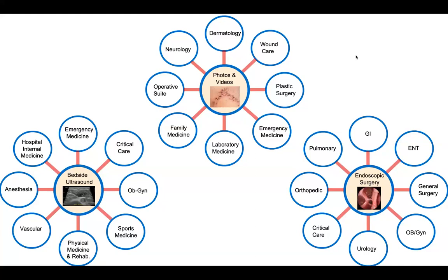So encounter-based workflow has been successfully employed in a lot of different settings to capture and assign metadata to these basic areas, like point of care ultrasound at the bedside with various specialties that do it, and photos and videos that can be of any number of different things, normal body parts, abnormal body parts. When you really zoom in on some small clinical area, a lot of times you don't know what body part it is or what pathology it is, because in many cases people are taking pictures of things that are really abnormal.